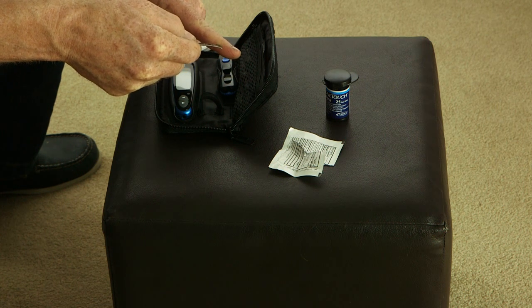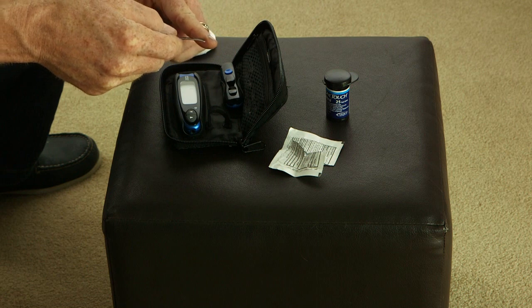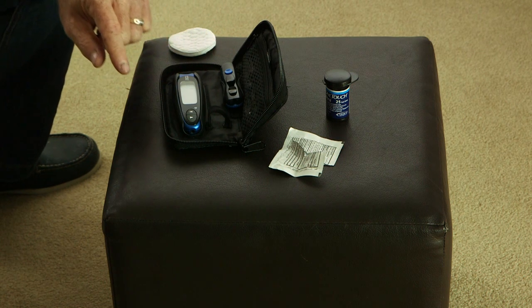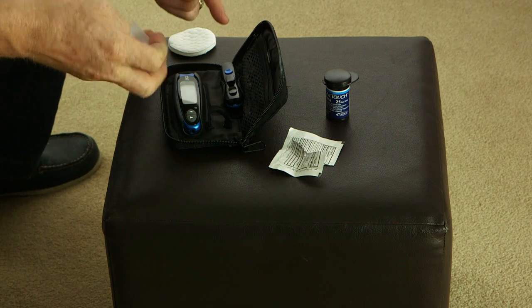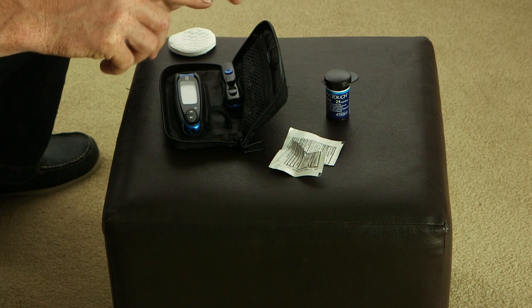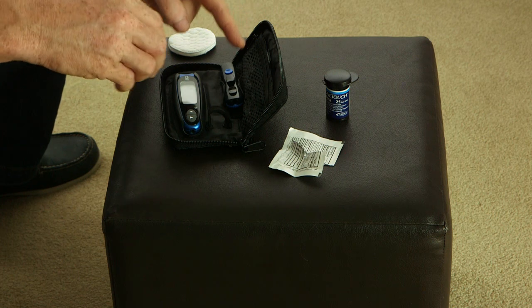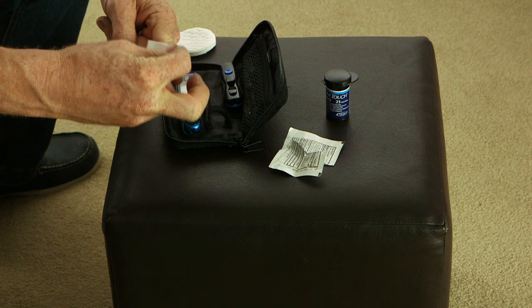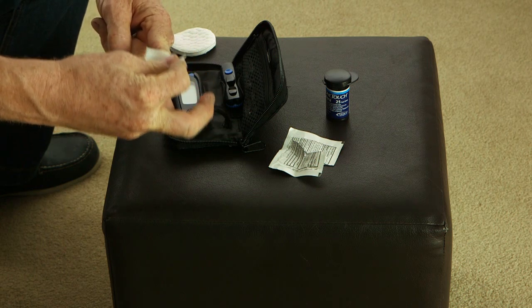It's still pretty fleshy, but there's not a large number of nerve endings like there are right on the pad. So you can get good blood, but not a whole lot of nerves. And you can select the outside, the inside, and you can use every finger. So if you're doing this often, you can rotate sites really easily. So I'm going to do this index finger right here. I'm going to swab it really good.